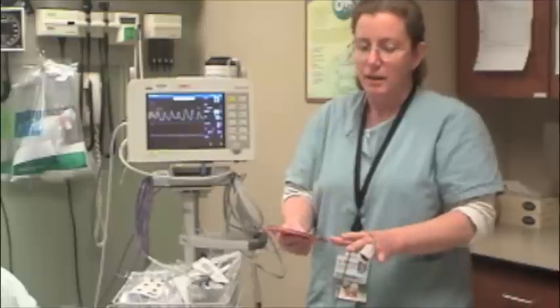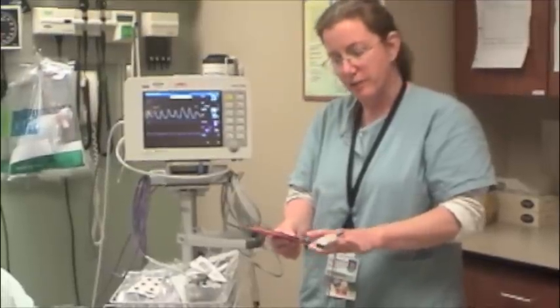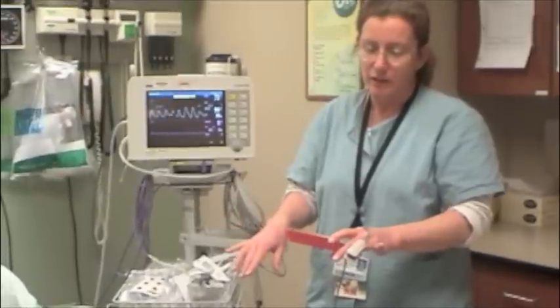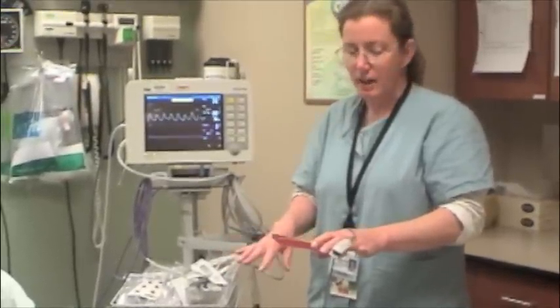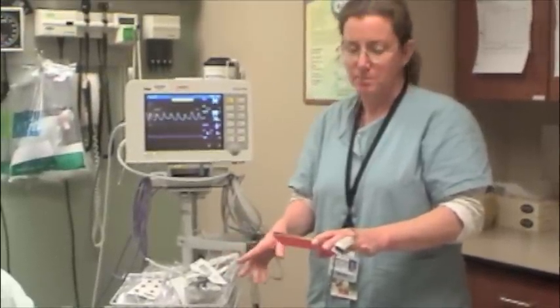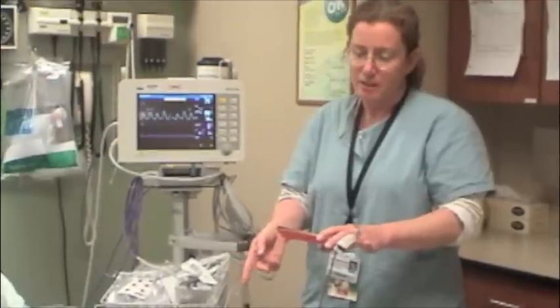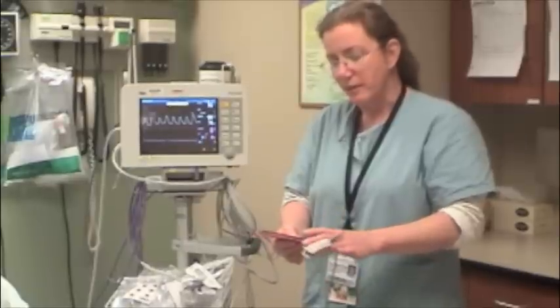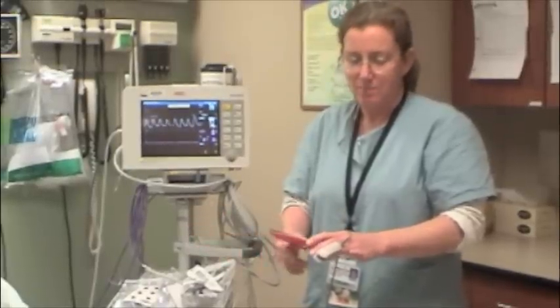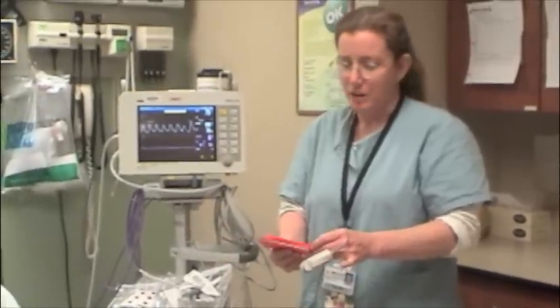Hyperventilation is when the end-tidal CO2 is less than 35 and your CO2 level is declining. Possible causes include anxiety, bronchospasms, hypotension, pulmonary edema, decreased cardiac output, or even overzealous bagging of a patient with an advanced airway in place.